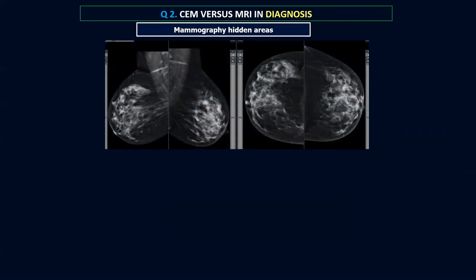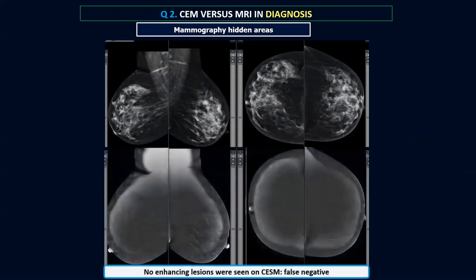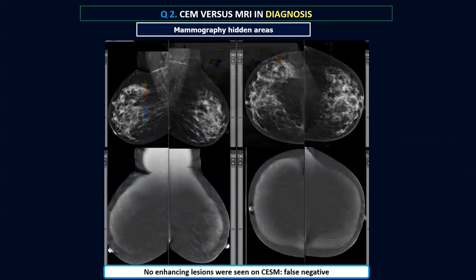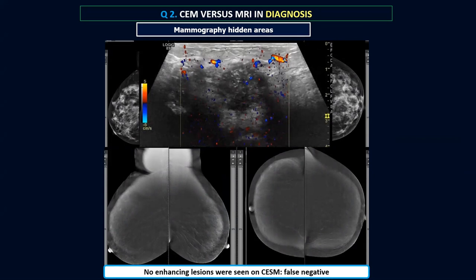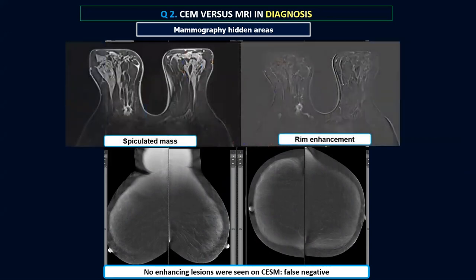Another case: a palpable mass lesion in the upper inner quadrant of the right breast. The contrast mammogram was interpreted as normal, despite a spiculated mass lesion being deeply seated on complementary targeted ultrasound. Looking at her MRI, the lesion was present but missed on contrast mammography because it was in one of the mammography hidden areas — deeply seated in the upper inner quadrant of the right breast.